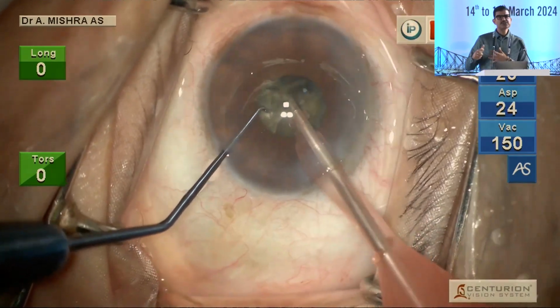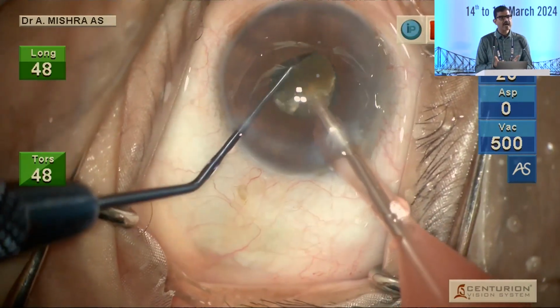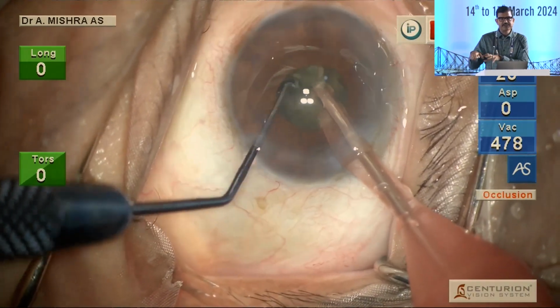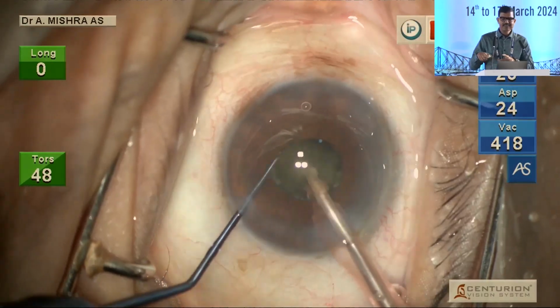Nothing much needs to change on the parameter front. As you can see, the IOP still is maintained at 20. There's a pretty hard nucleus. The pupil is small. You just need to understand that the business area is right at the center, and you don't need to go chasing the nuclear pieces, and they just come to you.